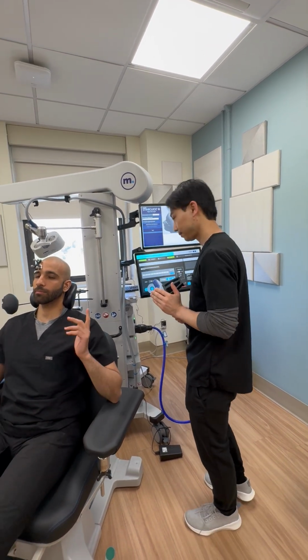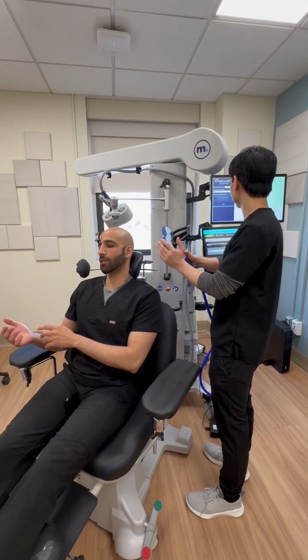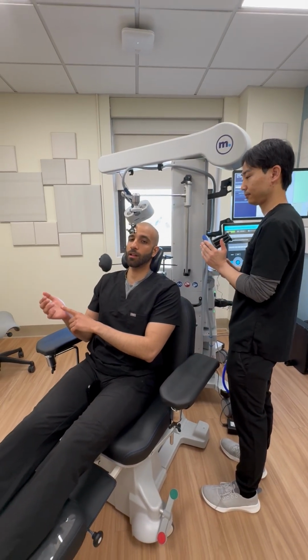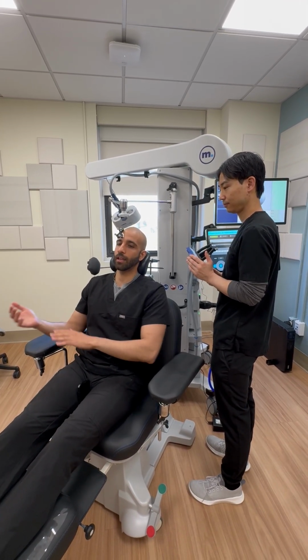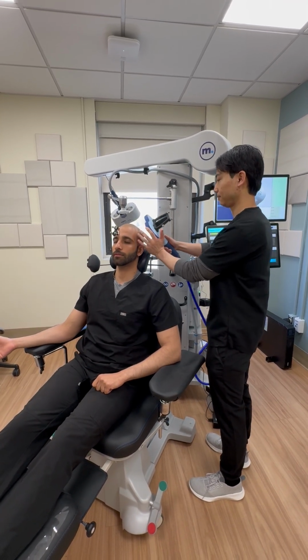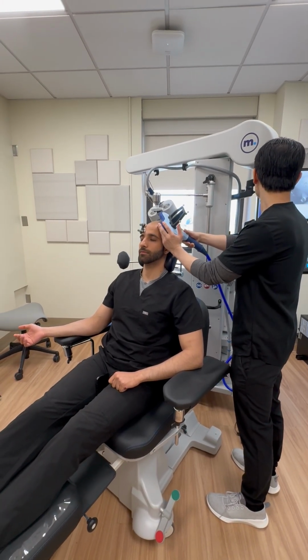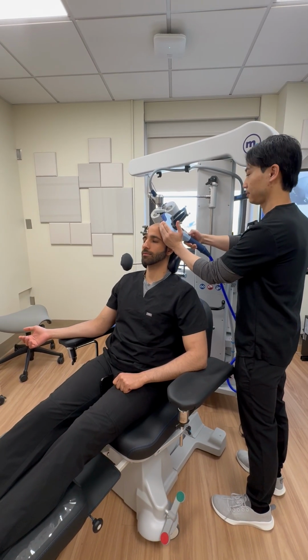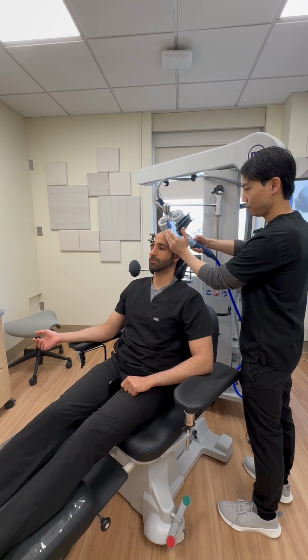And what he's doing is placing the coil on my motor cortex that's associated with the abductor pollicis brevis. So we want to see this move, or generally anything in the hand to move. So we saw the hand move there.